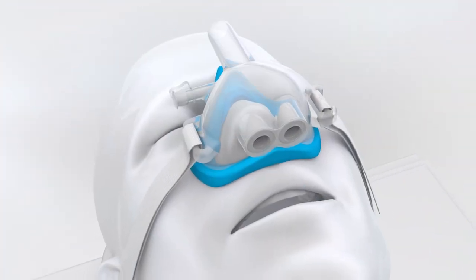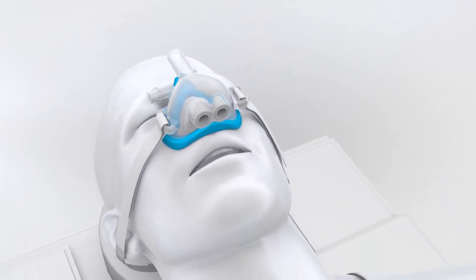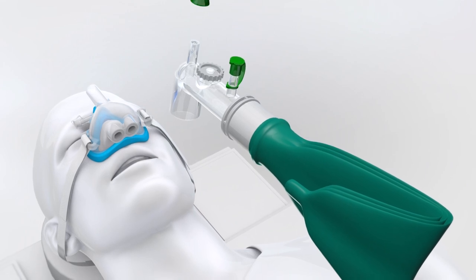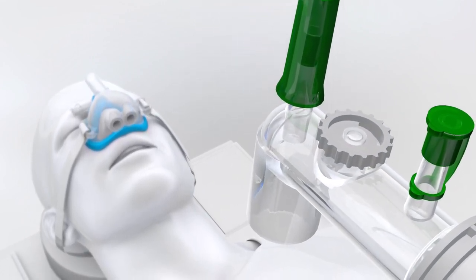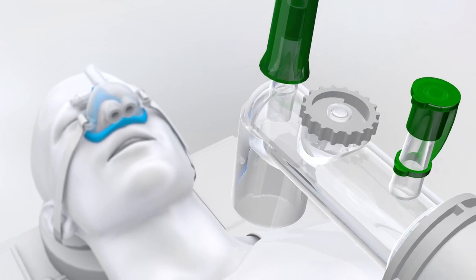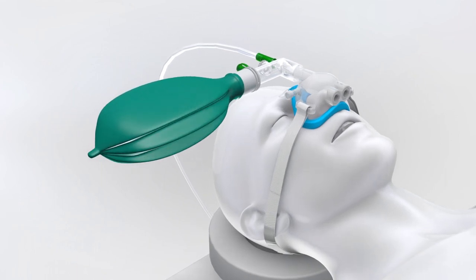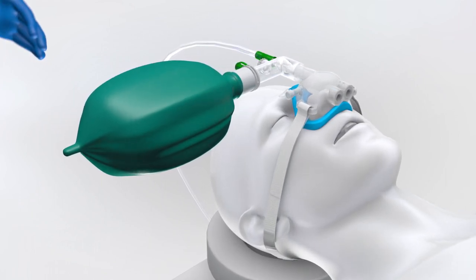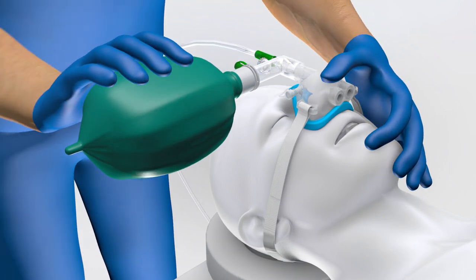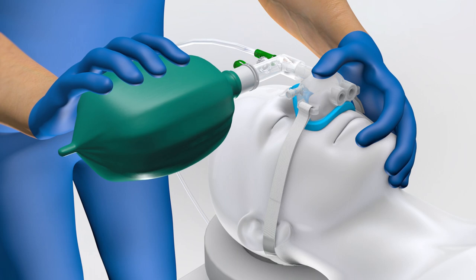In remote locations where anesthesia machines are absent, the SuperNova device is effective with the use of a hyperinflation bag and supplemental oxygen source. Similar to the anesthesia machine, a pressure relief valve present on the hyperinflation bag is used to titrate pressure buildup within the mask and intermittent deflation of the reservoir bag is visualized to confirm successful patient inhalation. Additional ventilatory support and manual ventilations are also achieved by squeezing the reservoir bag in the same manner.